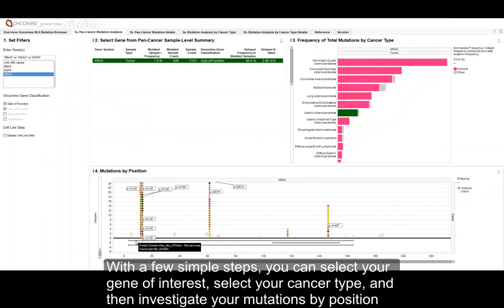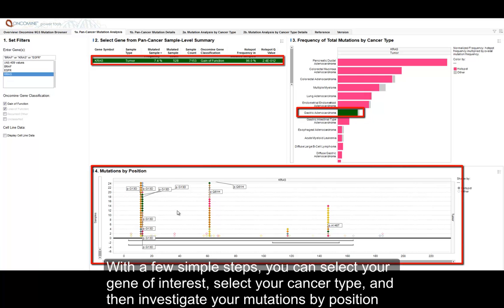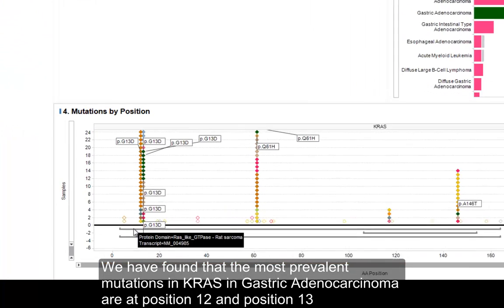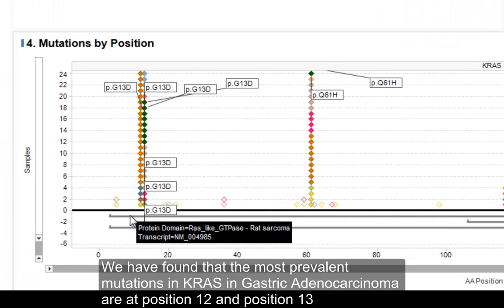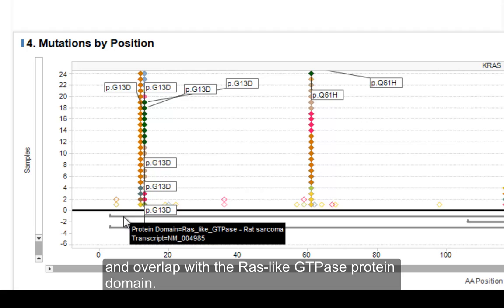As you can see, with a few simple steps you can select your gene of interest, select your cancer type, and then investigate your mutations by position. We found that the most prevalent mutations in KRAS in gastric adenocarcinoma are at position 12 and position 13, and they overlap with a RAS-like GTPase.